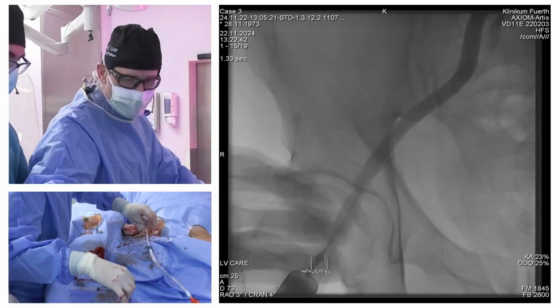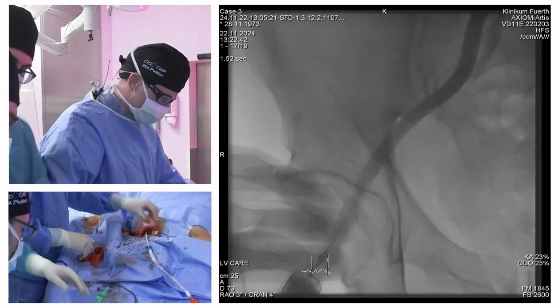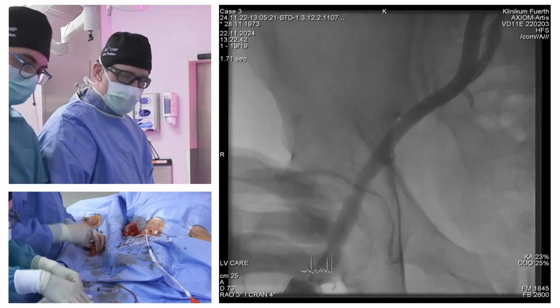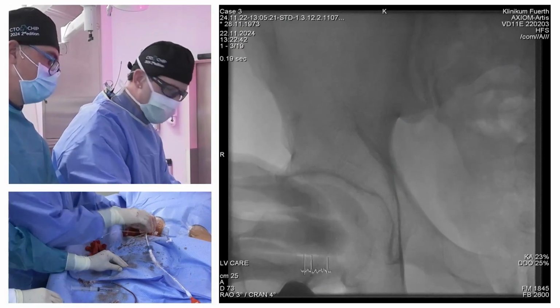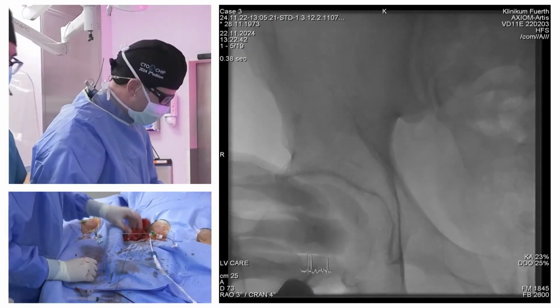One additional question on the femoral access. Do you do the pre-closure system now, or do you leave it alone? Yes, we did an ultrasound guided puncture with a micropuncture set. Then we pre-dilated with a 6 French sheath, and then placed a ProStyle.